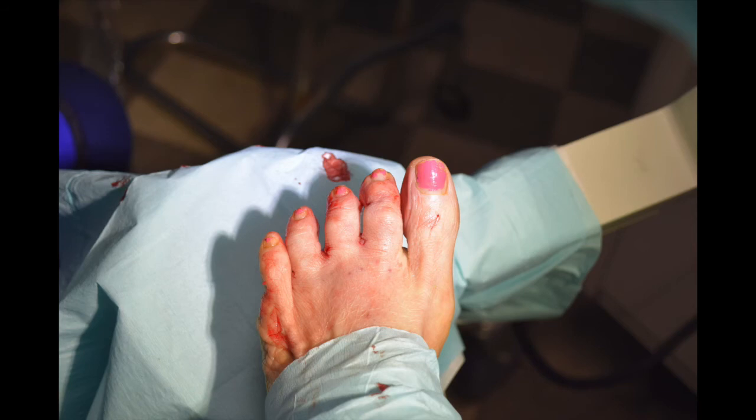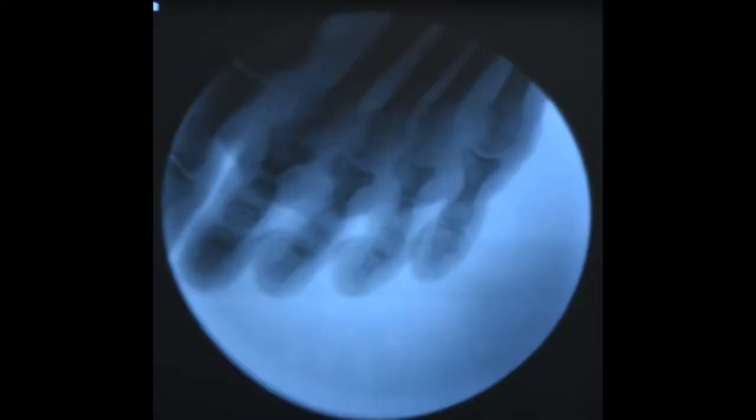This is how it looks on the table. We'll bandage the toes laterally to give us a good straight toe position. In this particular patient we did not do metatarsal osteotomies, though some surgeons do.